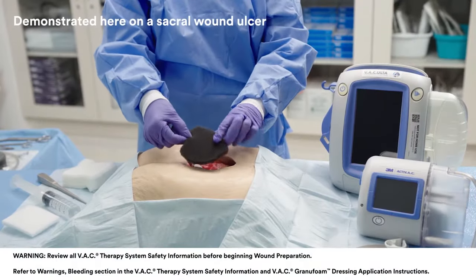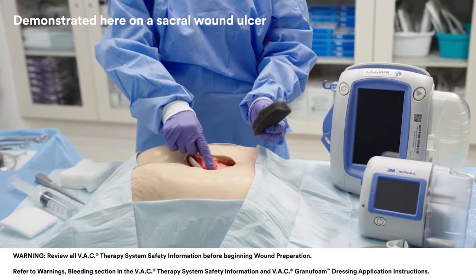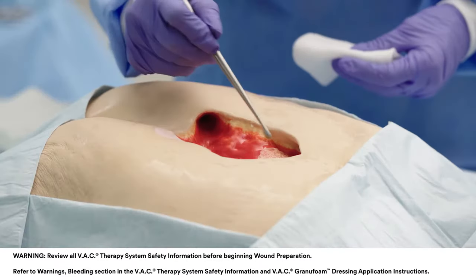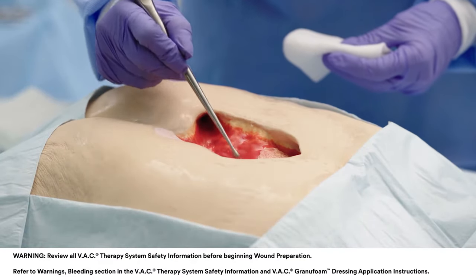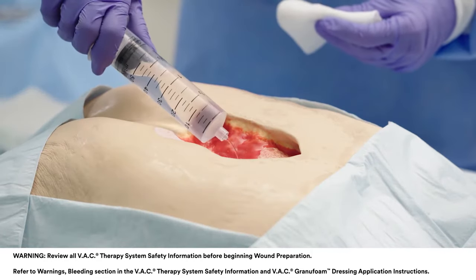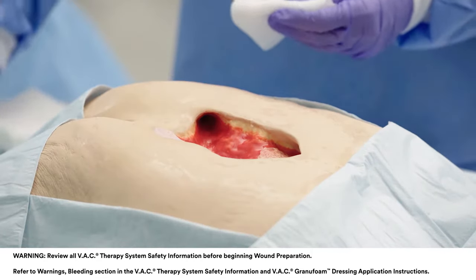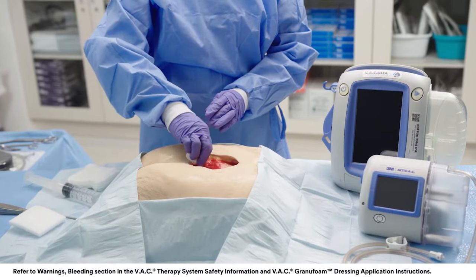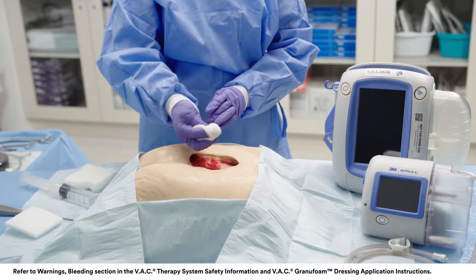Before applying a new dressing, remove and discard the previous dressing per institution protocol. Thoroughly inspect the wound to ensure all pieces of dressing components have been removed. Perform a thorough wound and peri-wound area cleaning per physician order or institution protocol prior to each dressing application.